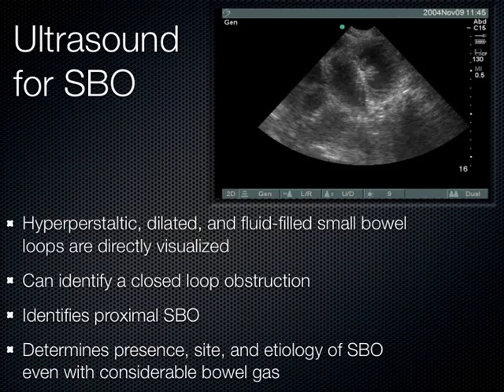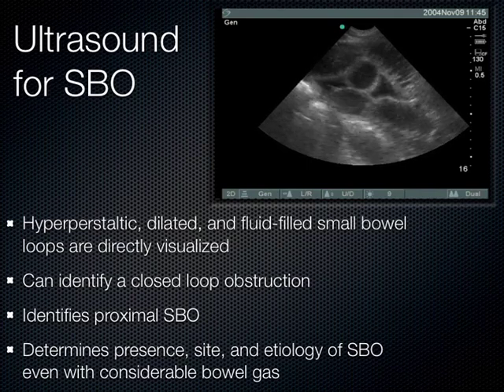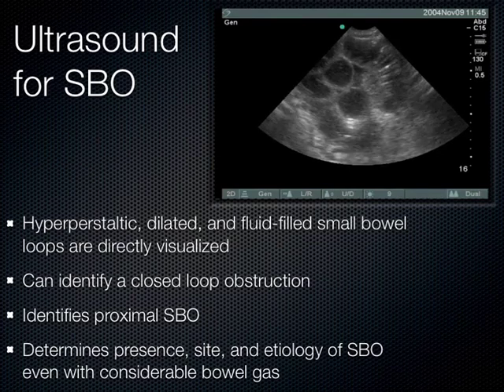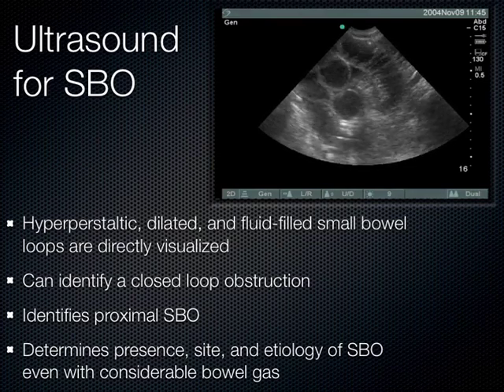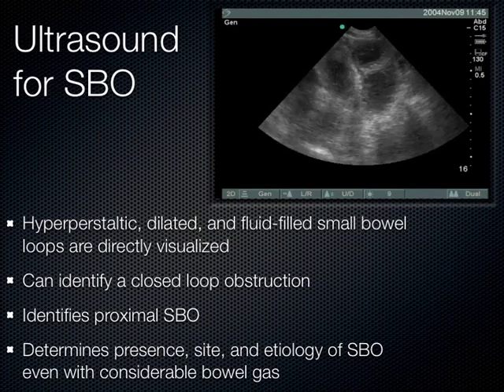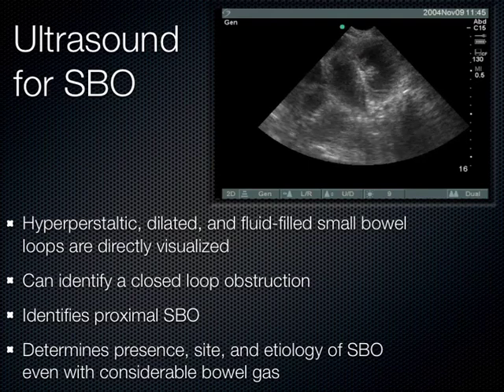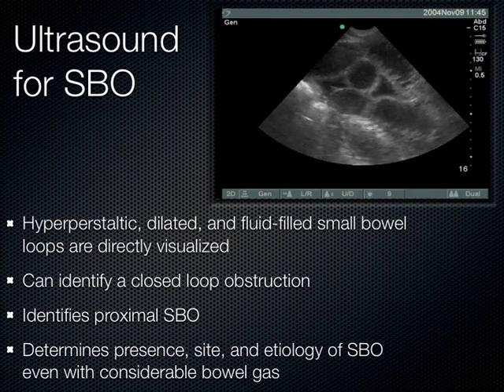And what you see with ultrasound is pretty easy to see, actually. If I've got a patient who's pretty distended, I just walk over with the ultrasound probe, they're vomiting, they've got all the clinical signs of small bowel obstruction. Well, this is what I see. I see these dilated loops here of small bowel. Notice the plicae circulares going all the way across the bowel there. The walls are usually thickened, though sometimes in the early small bowel obstruction, the walls have yet to become thickened.